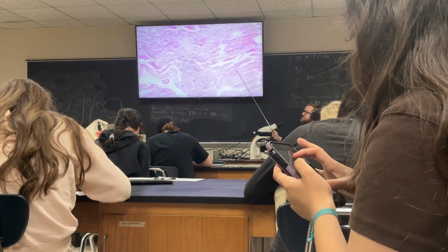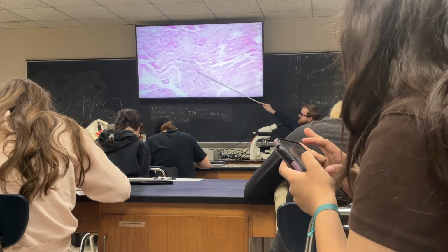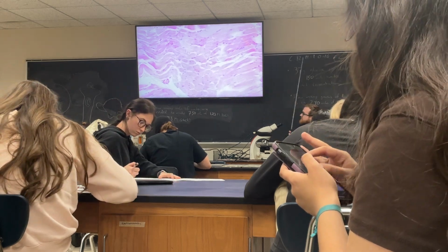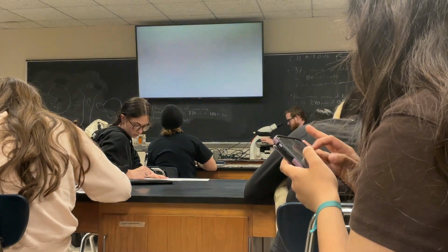So we have some muscle here that's going in the same plane as the TV. And then this is skeletal muscle coming in and out of the TV. And so you're cutting each cell off, so it looks like a little circle instead of a long stripe. So you might see that. I think I have better dedicated striated muscles somewhere.